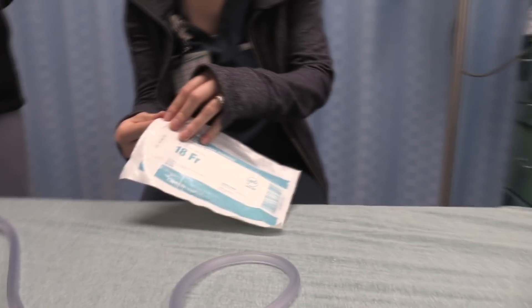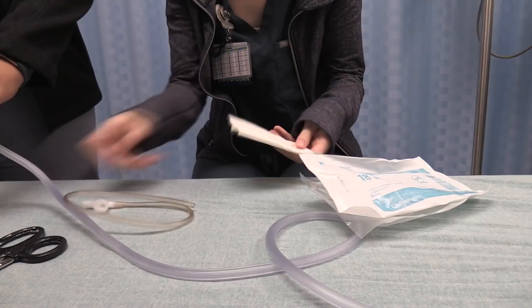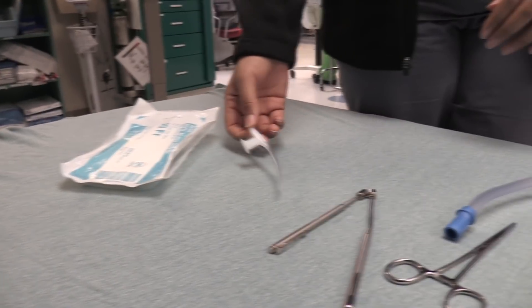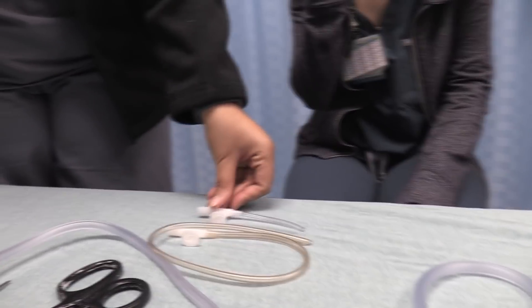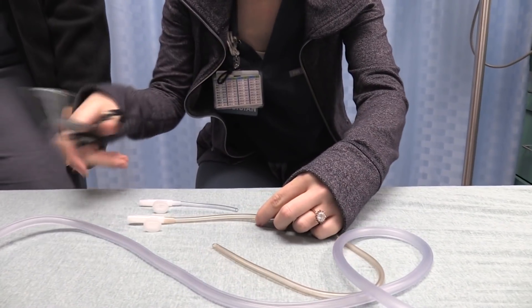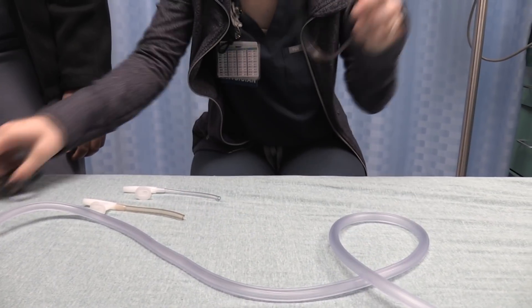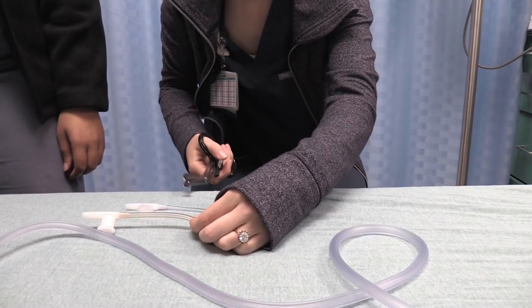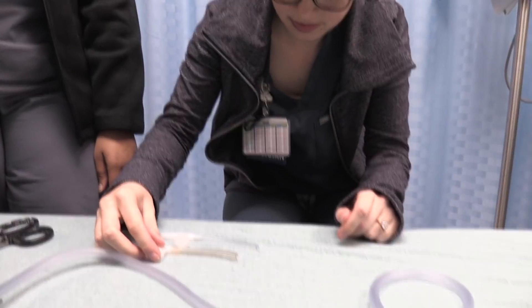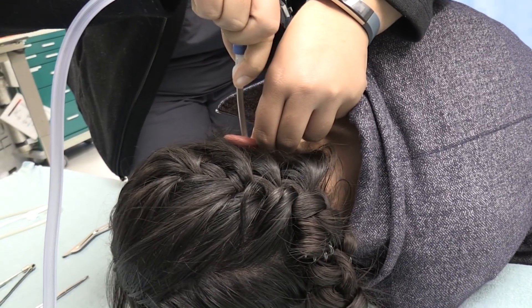Go ahead and open up the 18 French catheter and let's cut that one off too. Make sure that your cut is really straight across, not angular in any way. You may have to straighten out the canal just a little bit and maybe wait to apply suction to get down in there.